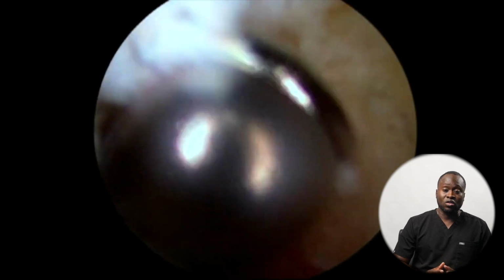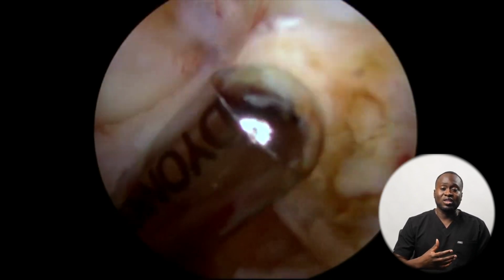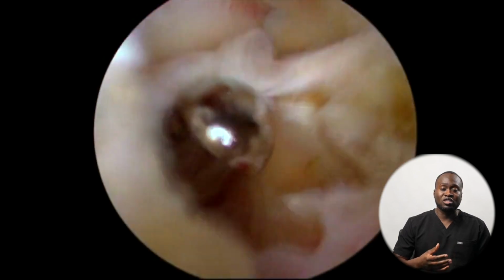Now, a question that comes up a lot is, how do you know where your tunnels are supposed to be? So we have a few different ways we can work on that. A big thing that's become important in orthopedic literature is the concept of anatomic reconstruction. And anatomic means that we're doing things exactly how the body was to start with, right?